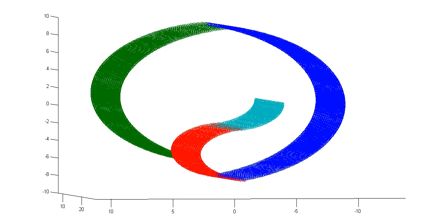Usually the form this takes is that you do an experiment, you collect voxel data in different conditions, say showing images of faces versus showing images of scenes, and you train a classifier, usually something like logistic regression. You have the voxel information and what image was shown at that time, so you train a classifier to learn that these voxel patterns relate to this kind of image and this other pattern relates to a different kind of image.